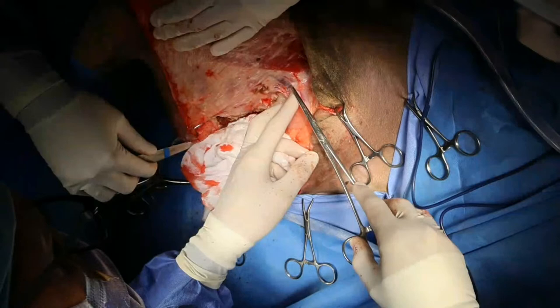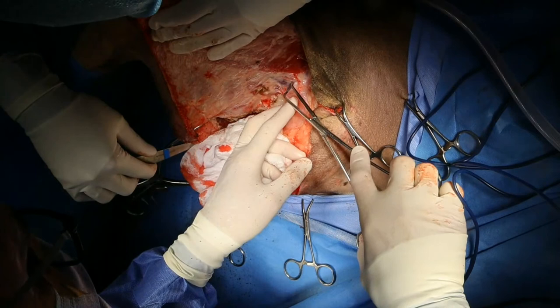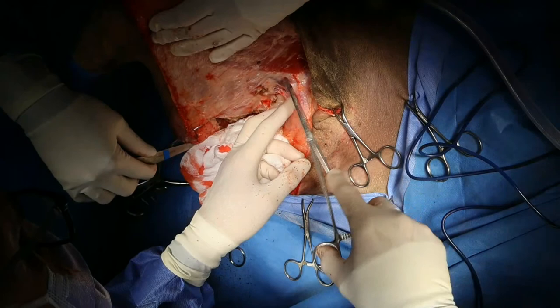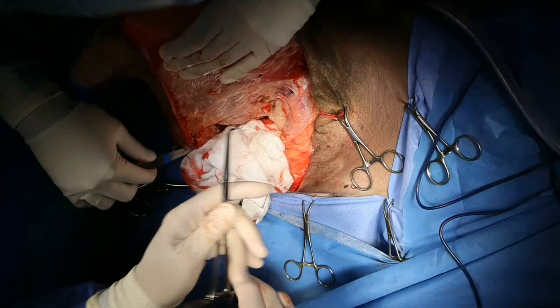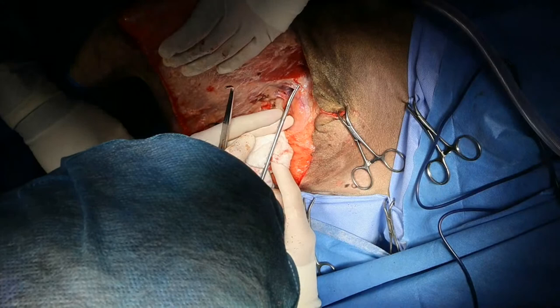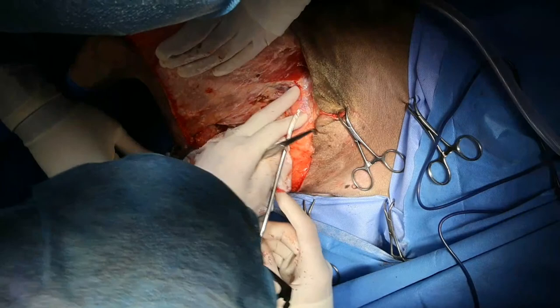So that's femoral vein right there. So I'm just trying to dissect out these vessels, and there's a lot of branching and stuff right in this region, which can make it tricky. And I have seen people inadvertently ligate the vessel and then cut proximal to it inadvertently. So that's my femoral artery, almost to the point of the iliac artery right there.